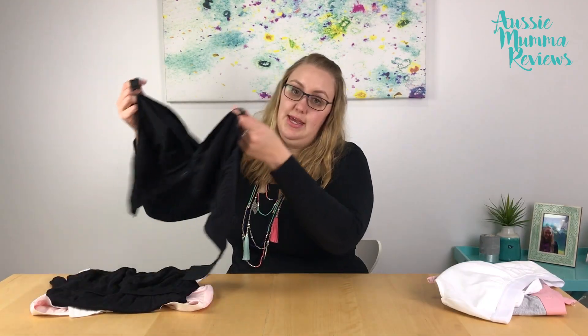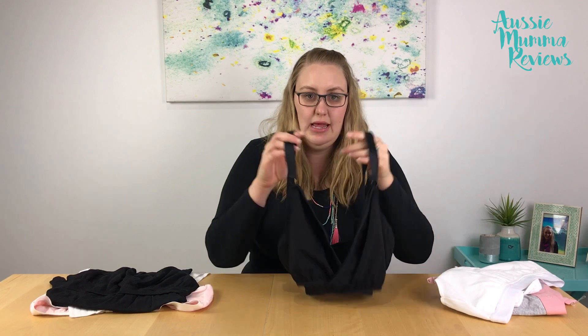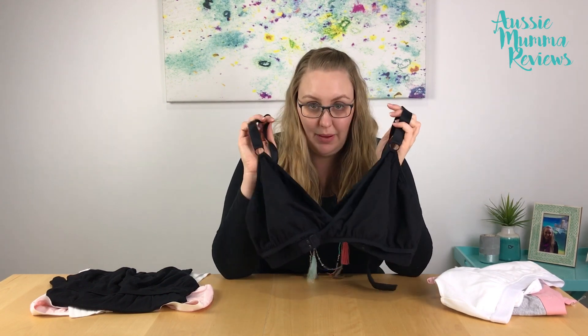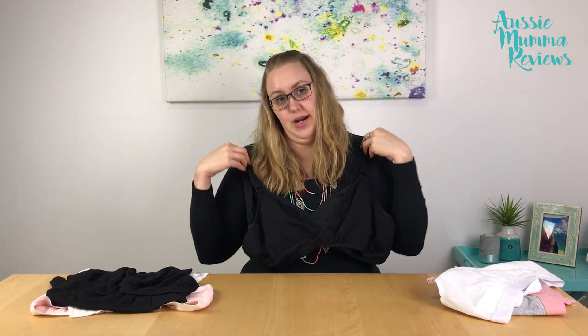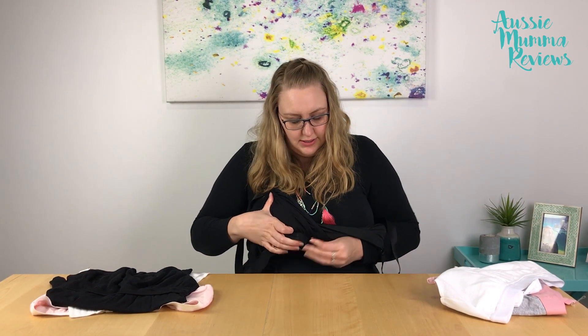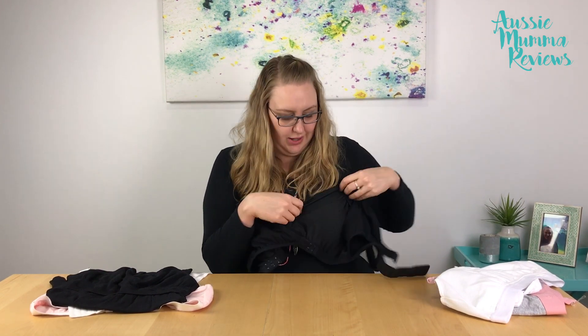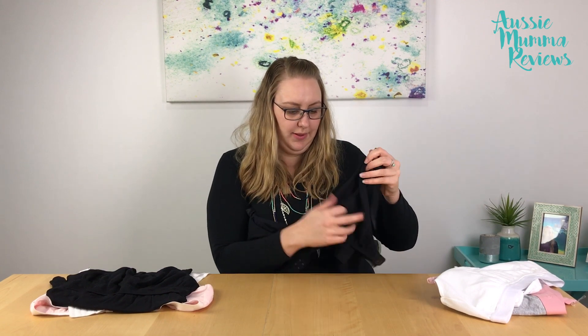The Arden Dairy Fairy bra is similar — it's designed as both a breastfeeding and a pumping bra, so you'd wear it as a regular bra. To pump, you undo the clip at the front which exposes the pumping part of the bra, and then to breastfeed you pull that down to feed. So this one also has that dual capability.